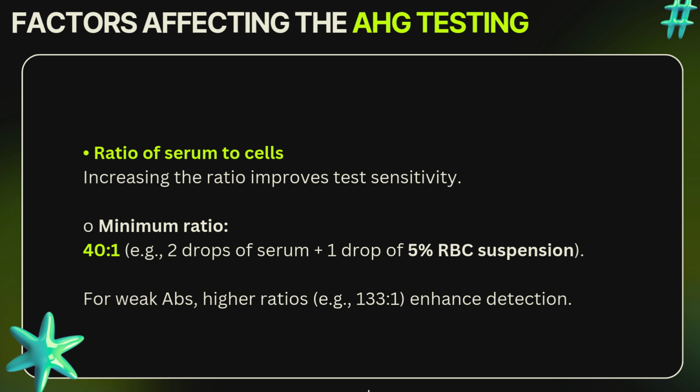This adjustment is crucial because it allows for more accurate detection and interpretation of results, particularly in complex cases where weaker antibodies are present. Remember, guys, the goal here is to refine our testing techniques to ensure we're getting the most precise and reliable results possible.